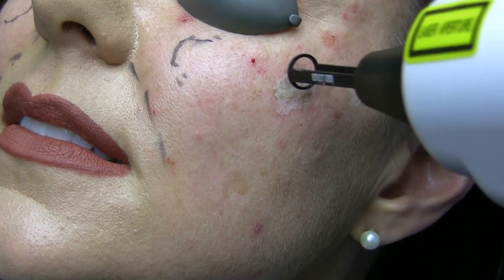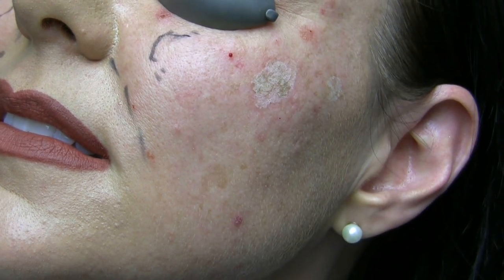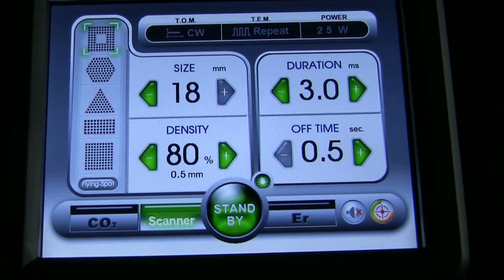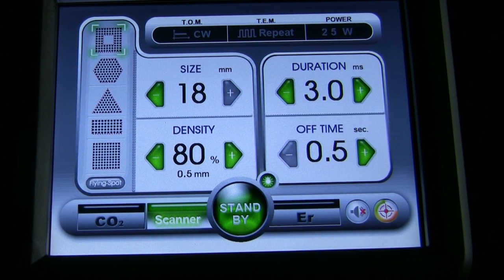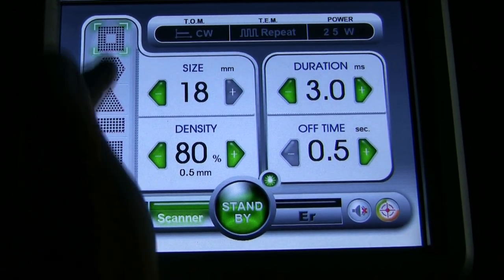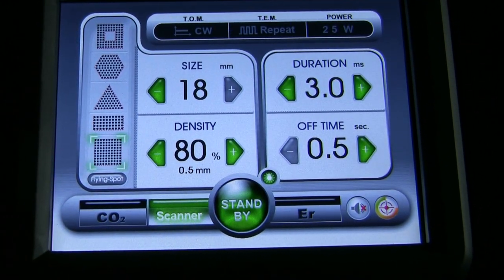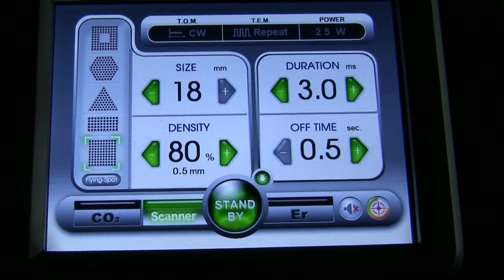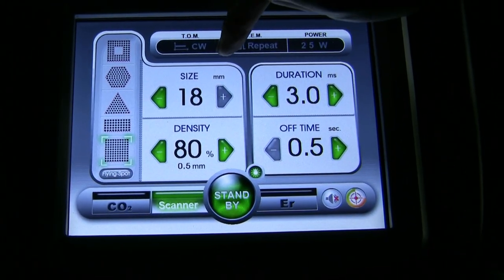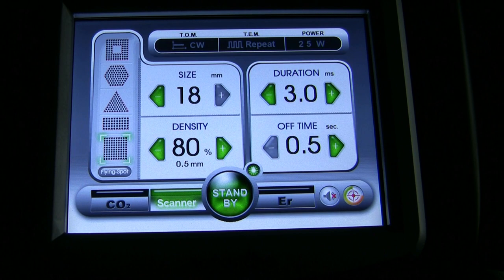So I'm doing two passes at 800 millijoules at a pulse rate of 4. We're talking about the Elman Cortex CO2 fractional laser with erbium and this is our control panel. Over here are the choices of your various patterns. For this procedure we're going to use a square pattern — the biggest pattern, which is 18 millimeters — and we're going to use a density of 80 percent.